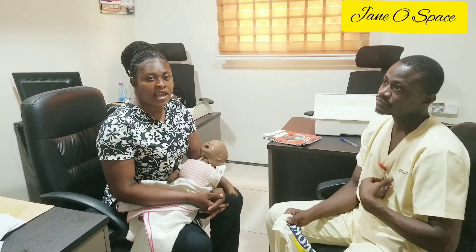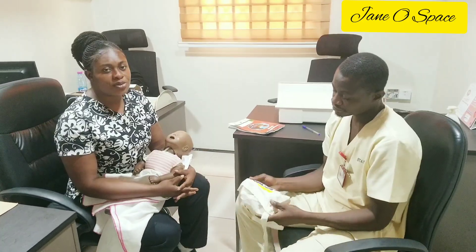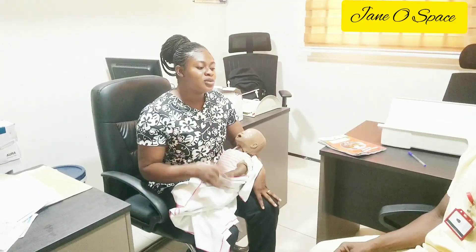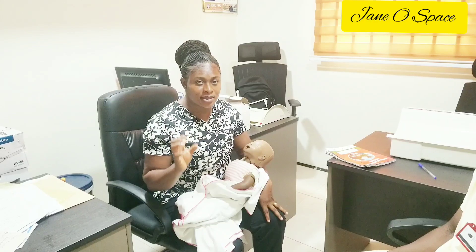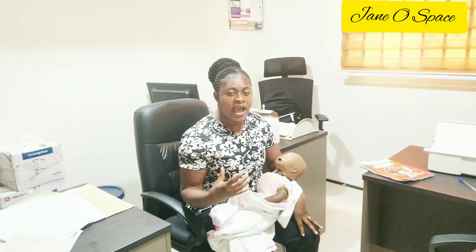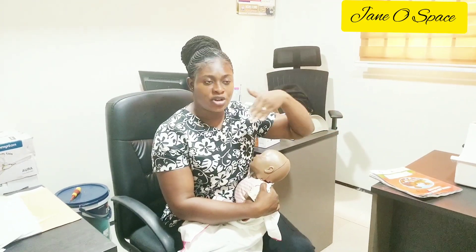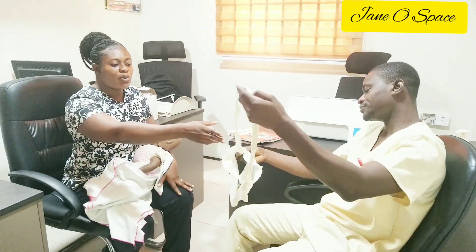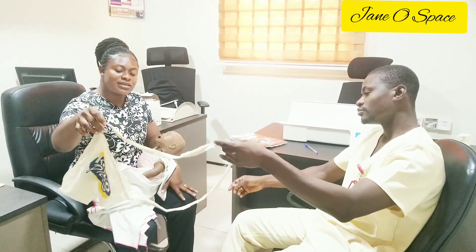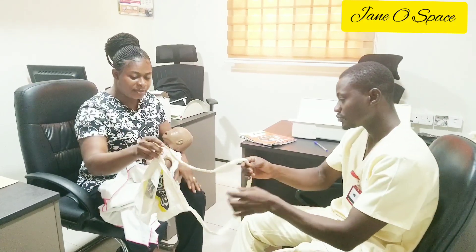Now we want to do a bit about the Salter hanging scale. So if you go for weighing at a facility where they are not using the toddler scale, you will know how to go about the Salter hanging scale. These are the weighing pants — that is the requirement.